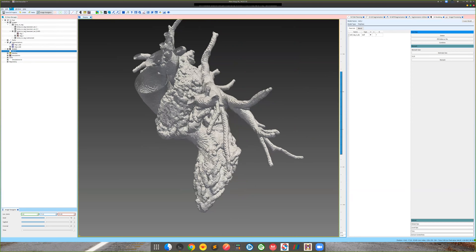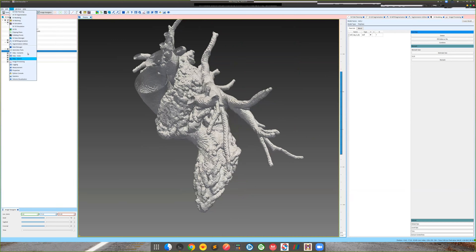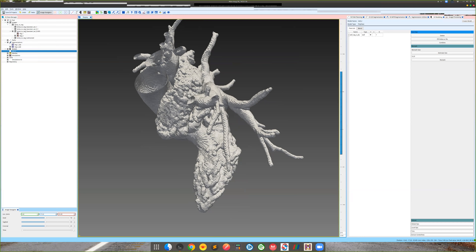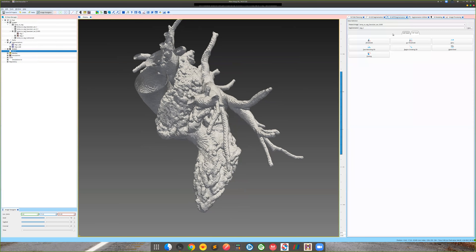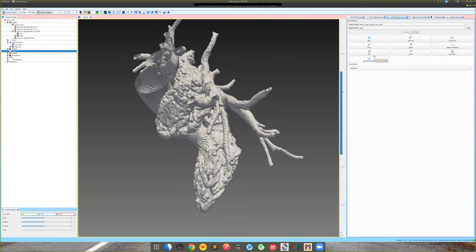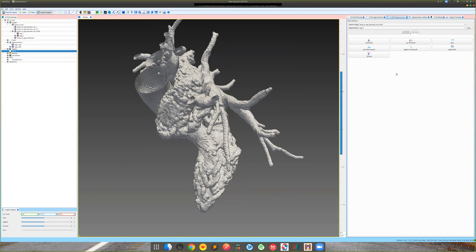I've gone through some of the main functionalities of the 3D segmentation tool. You can also explore the 2D tools — there's a paint brush, 2D fast marching, and a 2D version of the region growing algorithm. Feel free to play around with these tools and pick the one that works best for your problem.